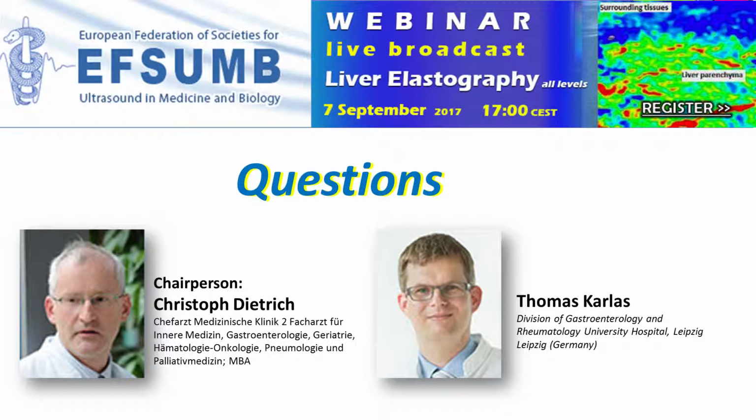You will find cutoff values. For point shear wave elastography, you might have some difficulties in finding cutoff values for rare liver diseases, but you will also have cutoffs for all common chronic liver diseases. And 2D shear wave elastography methods, especially from manufacturers which have provided their devices very recently, you will have problems in finding precise cutoff values for different liver diseases.